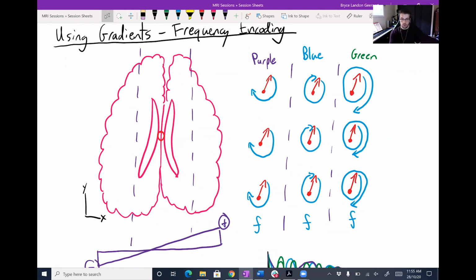Thanks for coming. Sorry, one last question I just noticed from recently, so it must be on the slide. Is it expected that the red arrows are not pointing in the same direction? Yeah, so for the timing of this diagram, I've drawn it post excitation, after the slice selection has happened and we've tipped the net magnetization into the transverse plane. At that point, we would expect our spins to be synchronized.